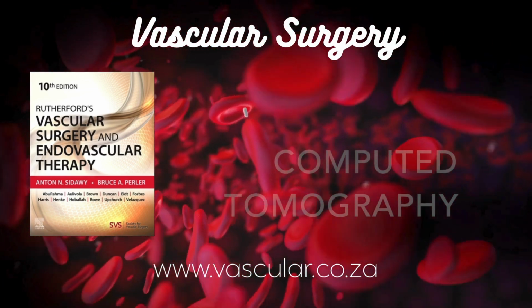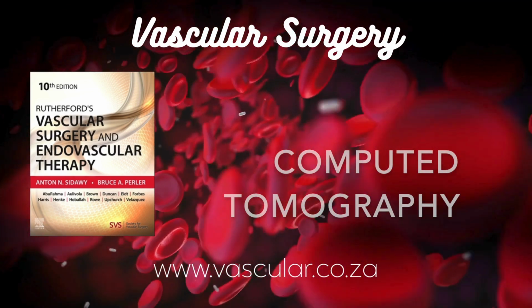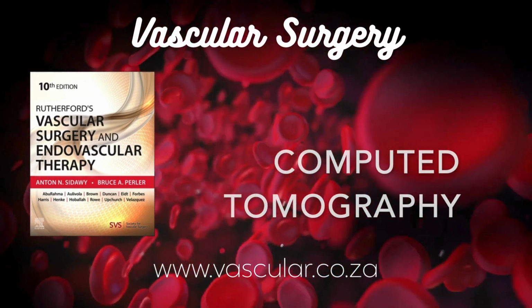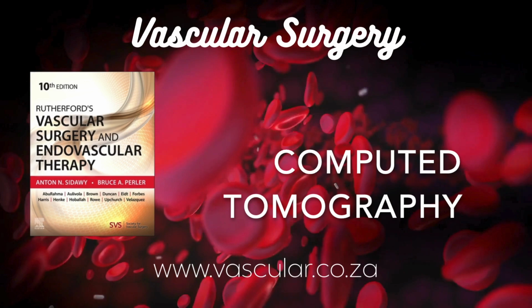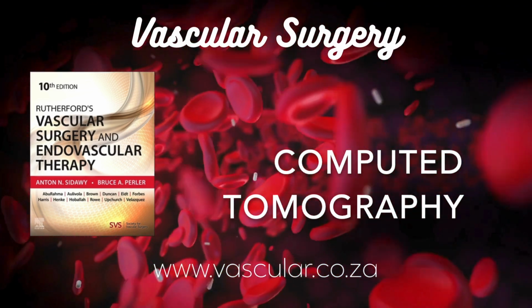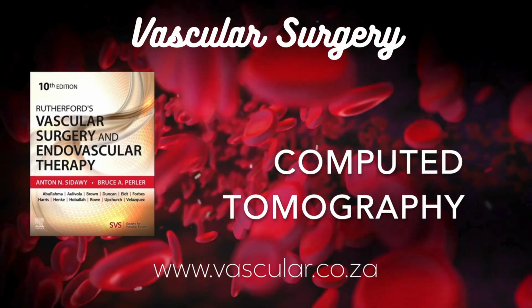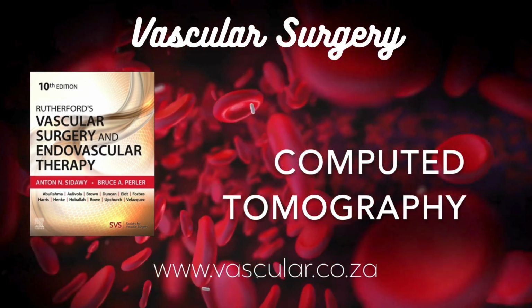Okay. And pitch. You mentioned that. Sounds technical. It's basically a ratio. It compares how far the patient table moves in one full 360-degree rotation of the gantry to the total width of the X-ray beam hitting the detectors, which is set by the collimation. What does that ratio tell you? It tells you how much overlap or gap there is between successive spirals of data acquisition.